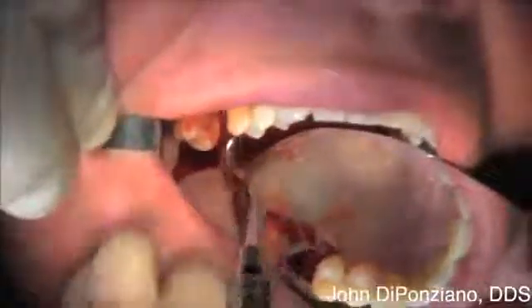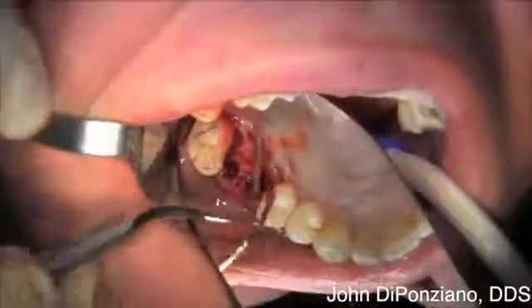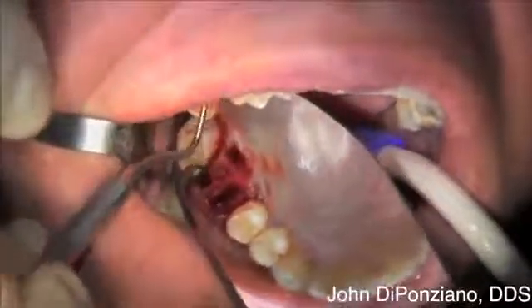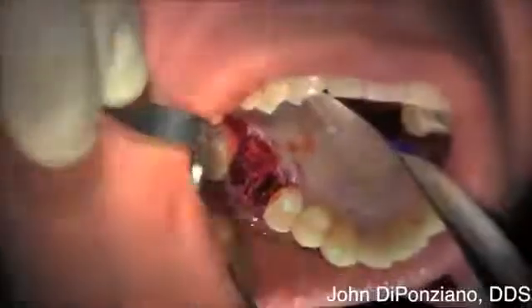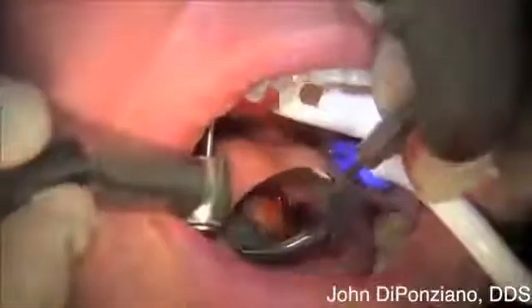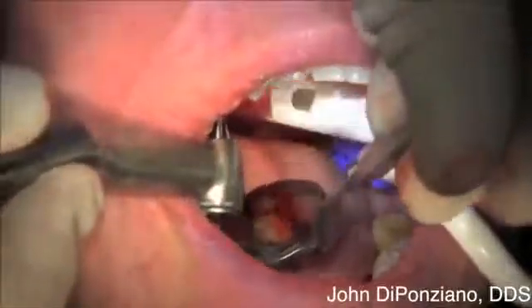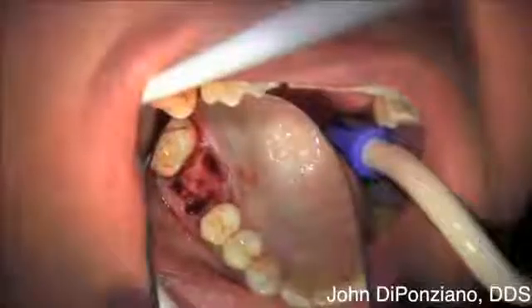Notice no vertical releasing incisions were placed. By using this curette, you can get underneath there and undermine it pretty well. There's a nice size furcation area and interproximal area, so we're going to place the implant right there. Using that same Comet burr just to get a purchase point to start the osteotomy right in the middle.